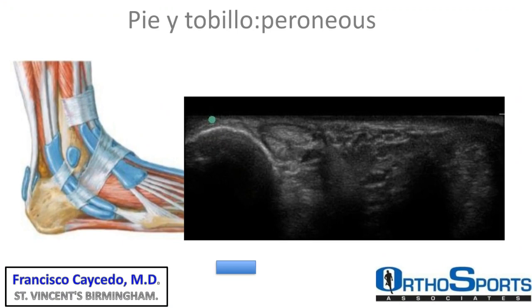In the lateral aspect, the position of the probe is transverse. So we start by identifying the hyperechoic structure, which is the fibula, and then you can see this fibular pattern below, behind the lateral malleolus. That's the peroneus tendon. You see the configuration.